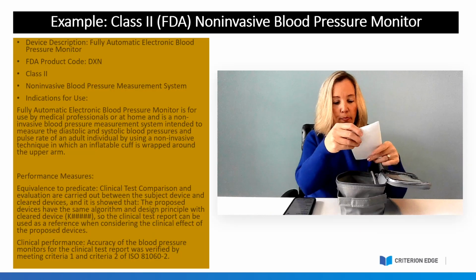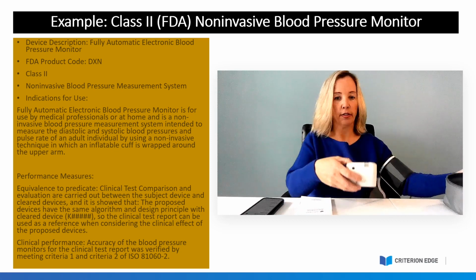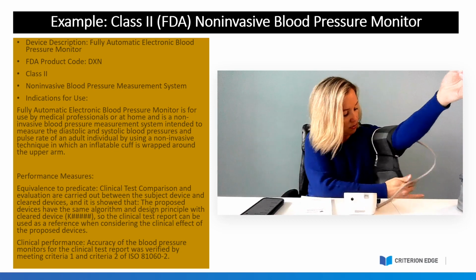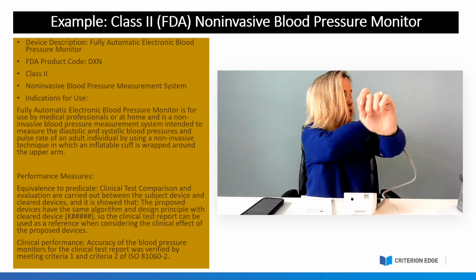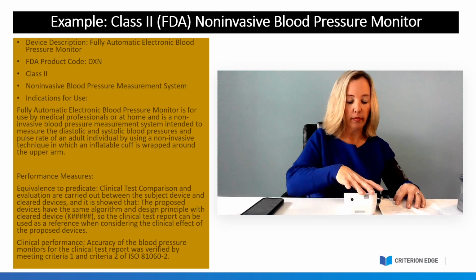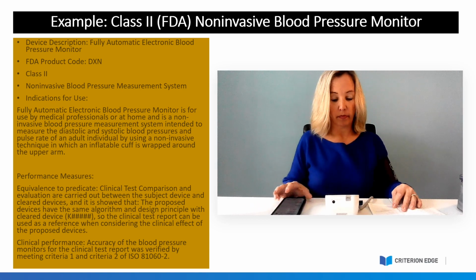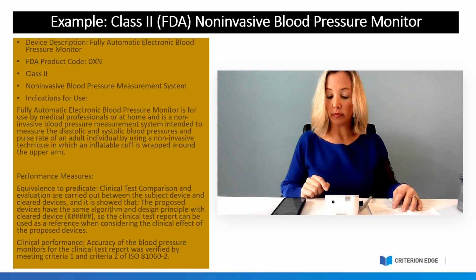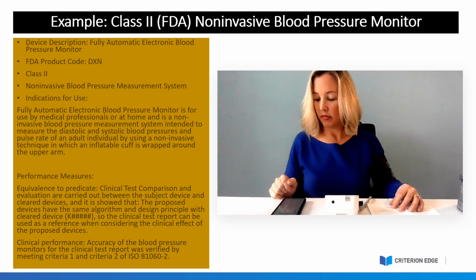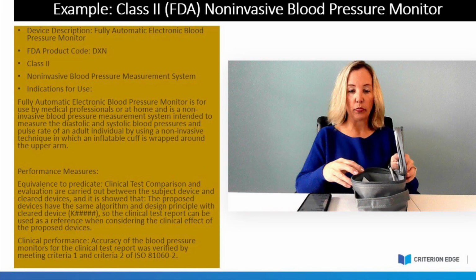Just got this new blood pressure monitor from my corporate wellness initiative. Let's see how it works. Okay, so it says open app on phone. Okay. Press start. Okay. Read results on your phone. Cool. That's pretty slick. This is also a medical device. I hope that helps.